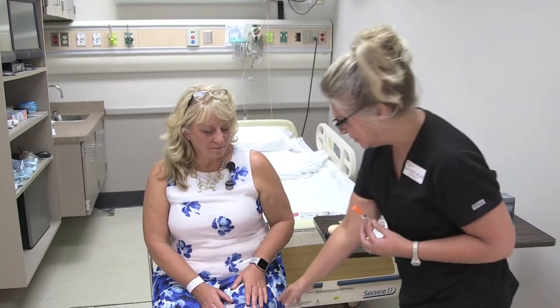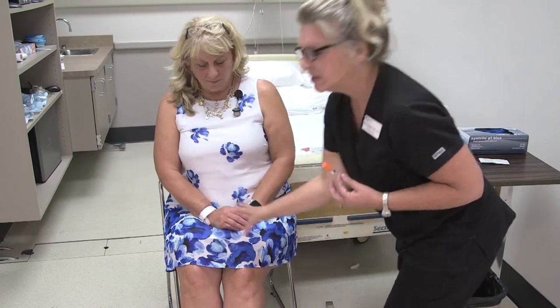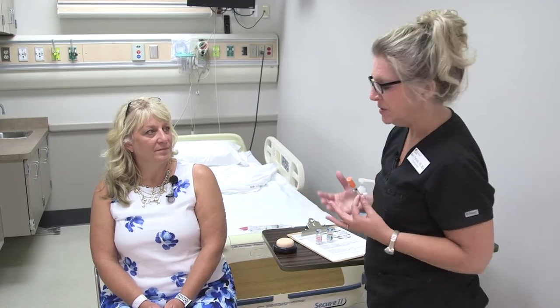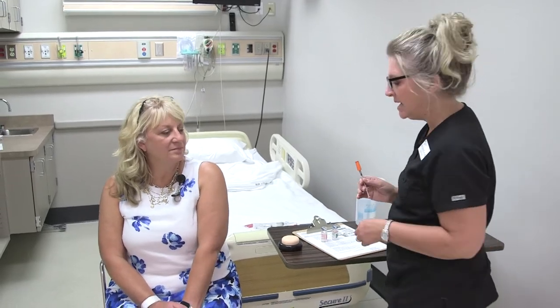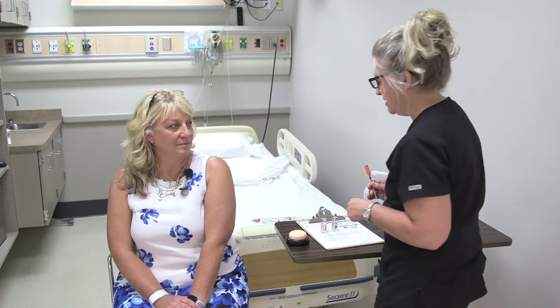Other areas for an insulin injection include the lateral anterior side of the thigh — right on the top of the thigh — and you can refer to your resources for that. The abdomen is probably the best place to give insulin; it has been shown to absorb much better in that area. If the abdomen is not an option, you can use one of the other sites. The patient should also rotate within one anatomical site rather than rotating to different extremities or parts of the body.